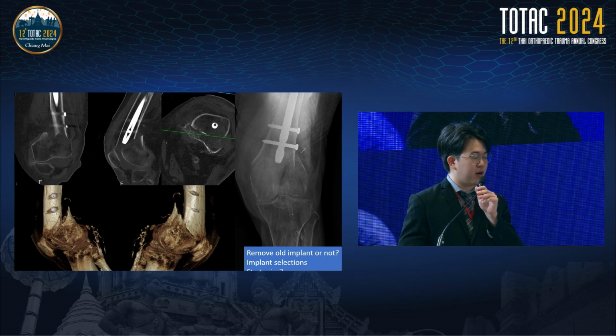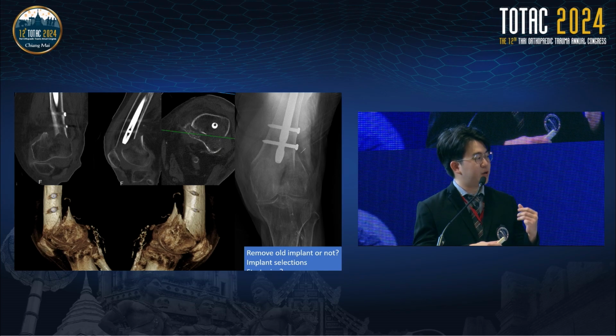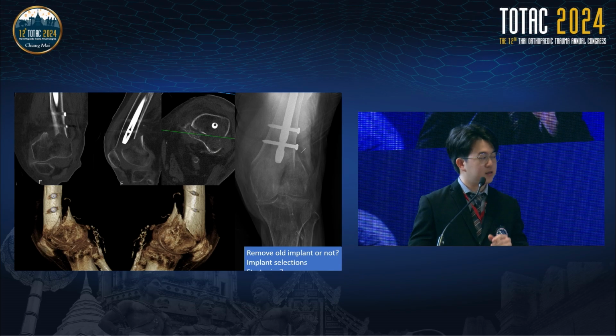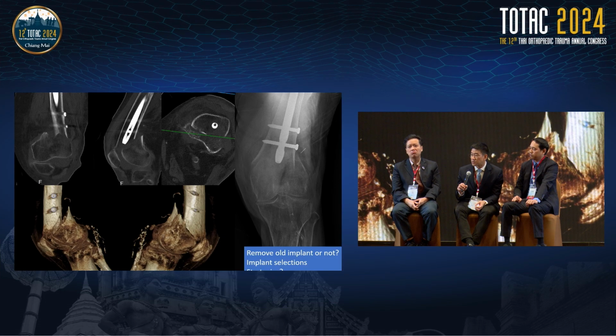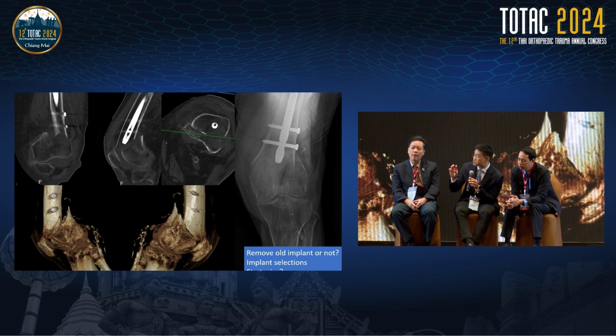Can I ask what kind of implant we will use for the medial plate? What implant do you choose? I choose a Philos, or maybe use the low bend distal tibial LCP. And for the proximal fixation, you might need a locking attachment plate, because the bone is quite small and the nail is quite large, and the locking attachment plate makes it easy to put a cortical screw around the nail.